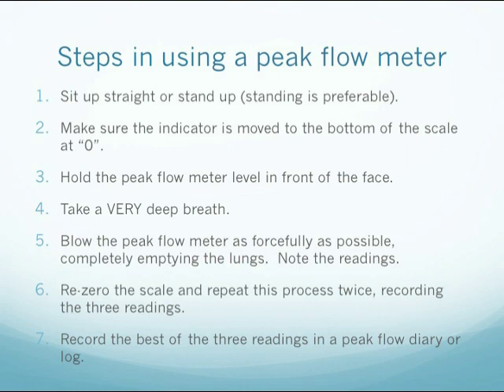Note the reading. Then re-zero the scale and repeat this process twice, recording three readings. Record the best of the three readings in a peak flow diary or log. The patient should breathe out from the diaphragm, not from the cheeks.